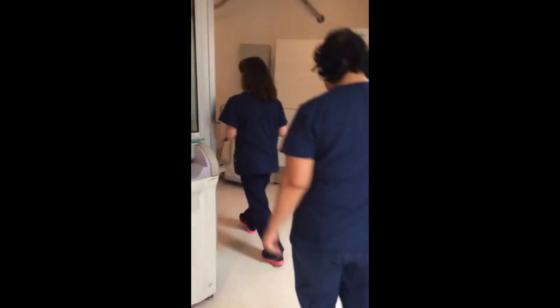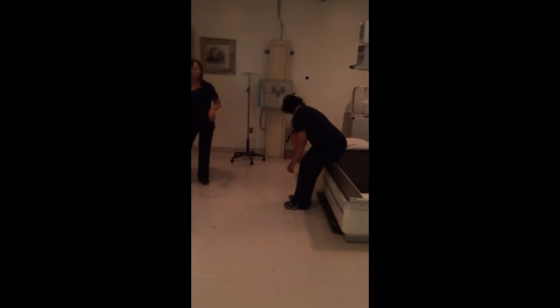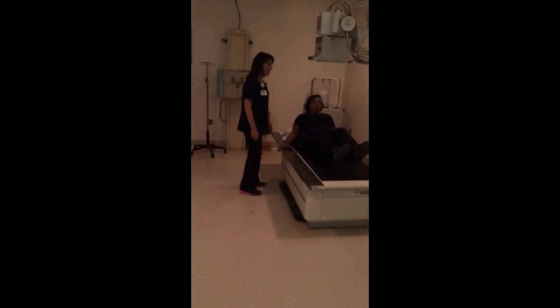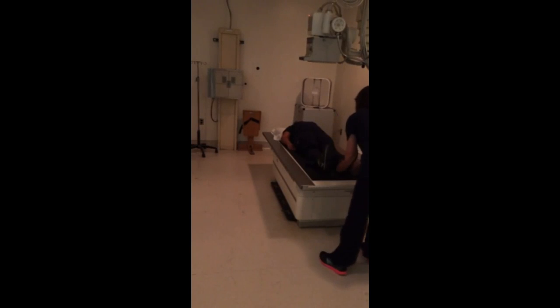Okay. Mrs. DeWitt, you ready? Okay, come on in. I'm going to have you go ahead and lie on the table on your back, please. Okay. All right. So the affected leg is fully extended, which is our left leg. Our leg is straight.